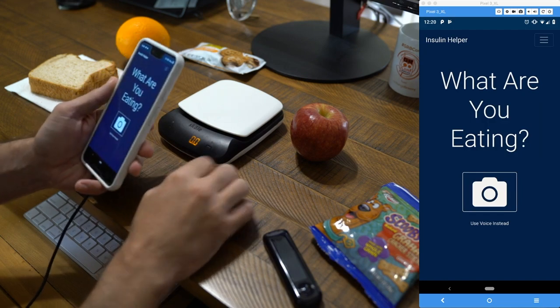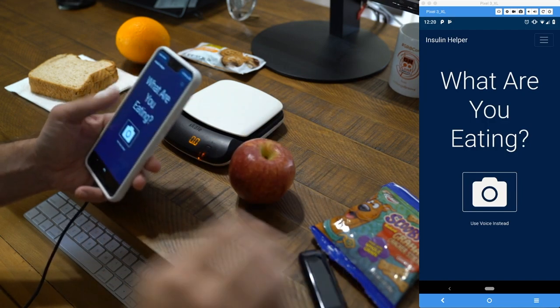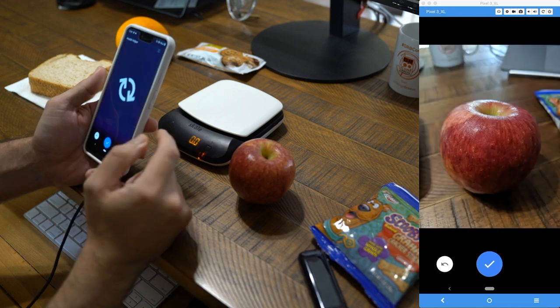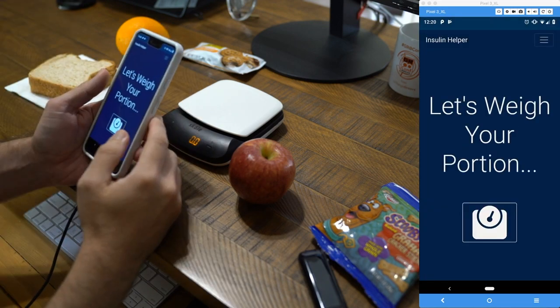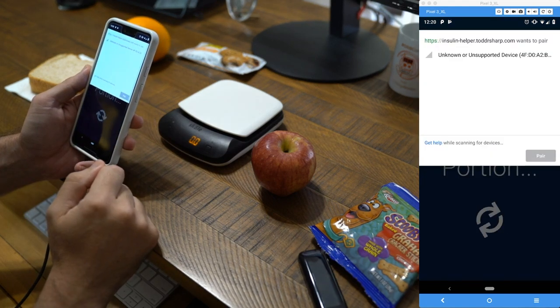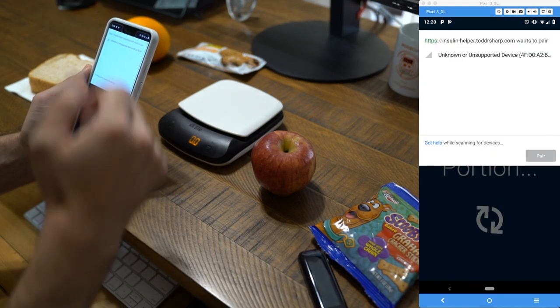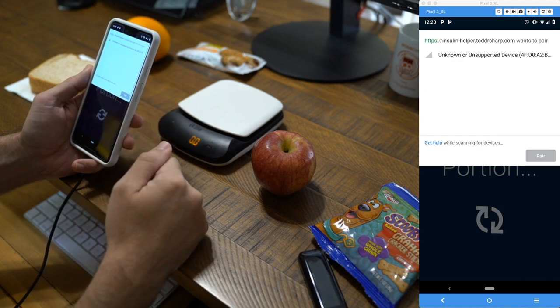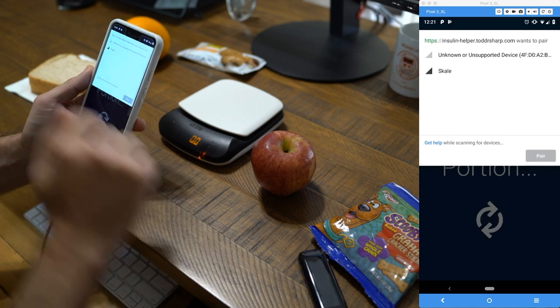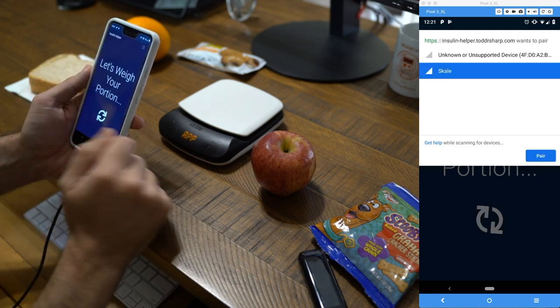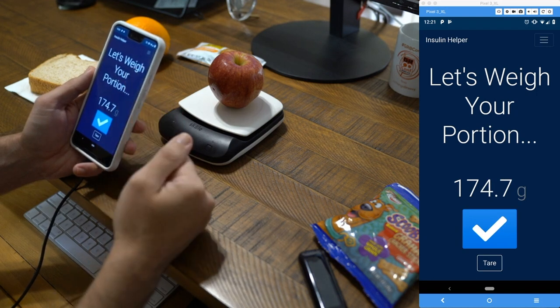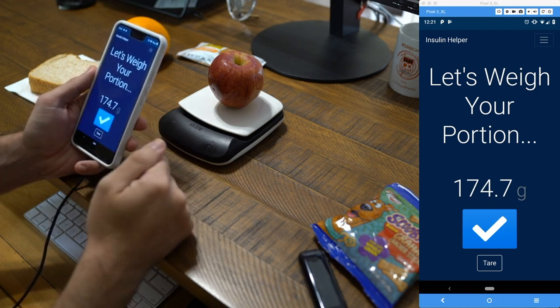We select a formula — let's choose 'test' — and say we're going to use a picture. We click the camera button, take a picture of our apple, and upload it. While the picture is being uploaded, we can weigh our portion. We have a Bluetooth scale here, and we pair it with the application by clicking the scale button, which scans for available Bluetooth devices. We make sure the scale is in pairing mode, it shows up, and we pair to it. Now we can weigh our portions — we put the apple on the scale and in real time the application shows our food being weighed.